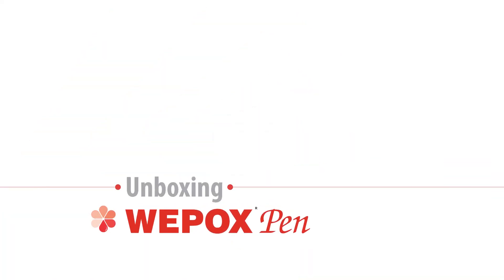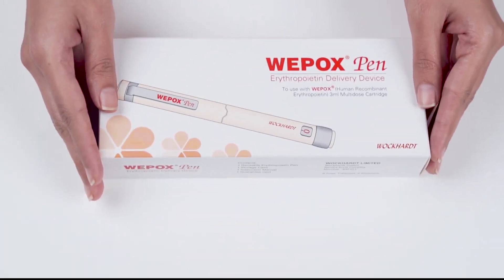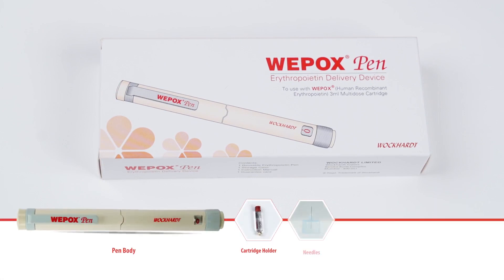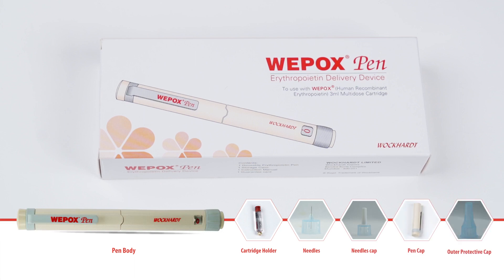Unboxing Wepox Pen: the Wepox Pen box consists of a pen device which has a pen body, cartridge holder, needle and needle cap, pen cap, and outer protective cap.